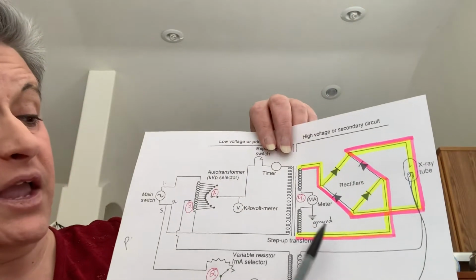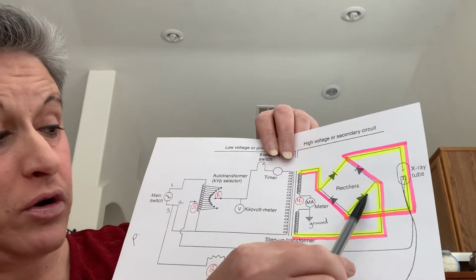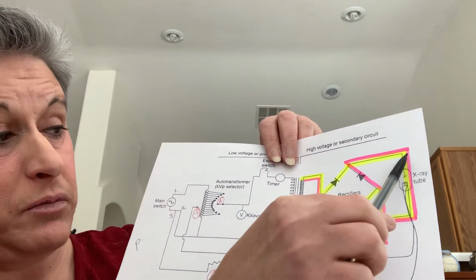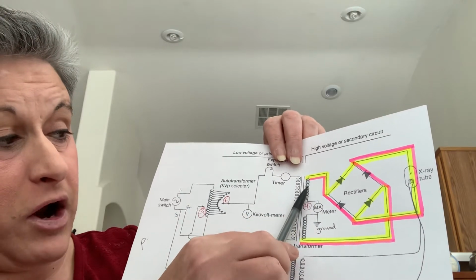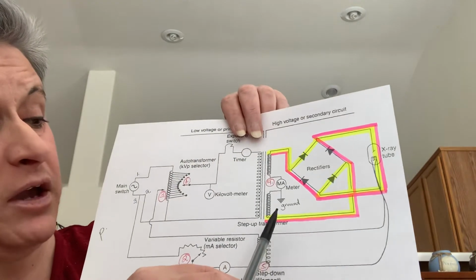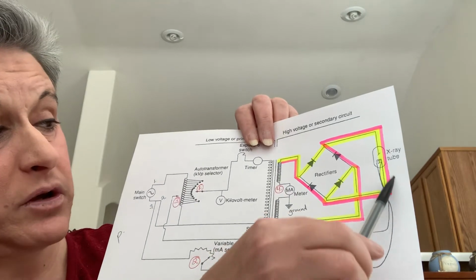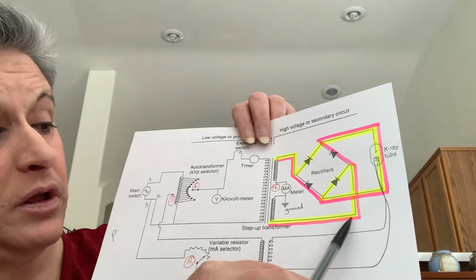The first pathway is the yellow. So it's going to go here, travel here, and then around, here, and there. So that's the first pathway. The second pathway I have in pink. You can travel this way, and it goes up, around, and that way. Okay, so those are the 2 pathways in the rectifier. And those, by the way, those pathways are happening simultaneously also. They happen at the same time.